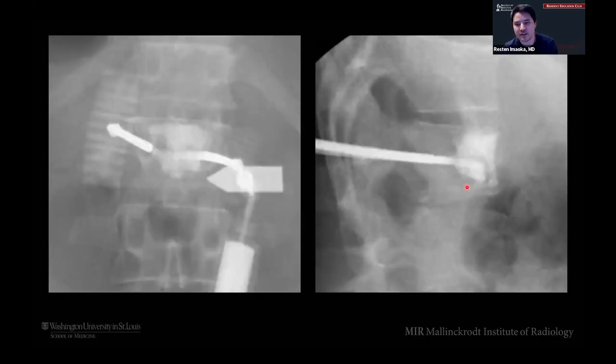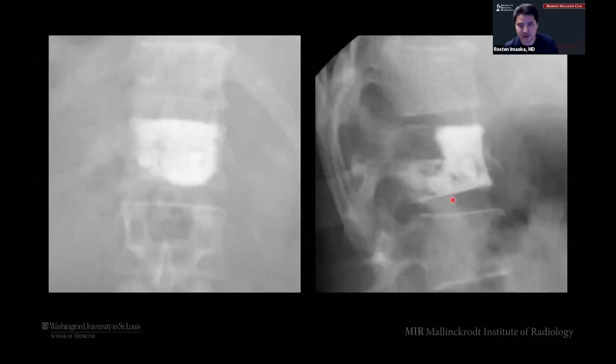And then you're just going to fill this in like any other kyphoplasty, right? So we've got a curved delivery cannula here. It's putting cement in. And we, again, are trying to make a creation of cement from pedicle to pedicle and then superior to inferior. So that's as it's filling. And then you get something that looks like this, right? So this was that sclerotic lesion that it didn't really fill that well, but everything else we filled in very nicely there. So this vertebral body is not going to collapse.